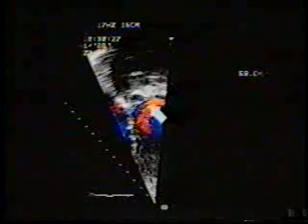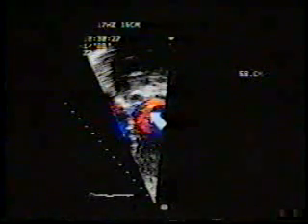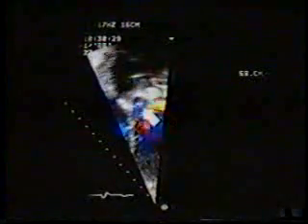This flow below the aortic prosthesis in diastole represents the normal antegrade flow through the adjacent mitral prosthesis. There is no prosthetic aortic regurgitation.